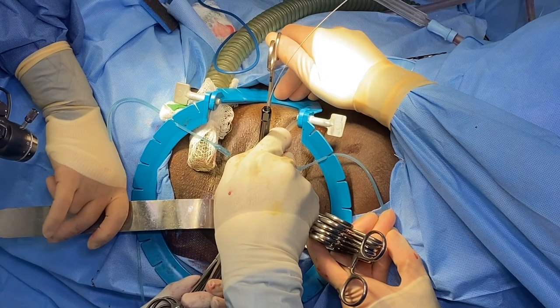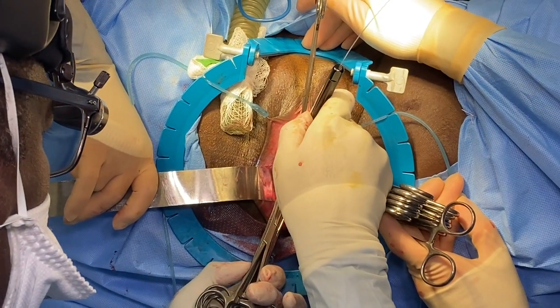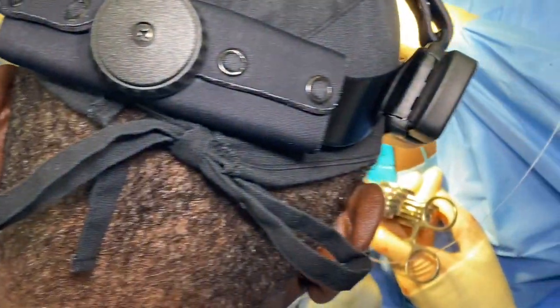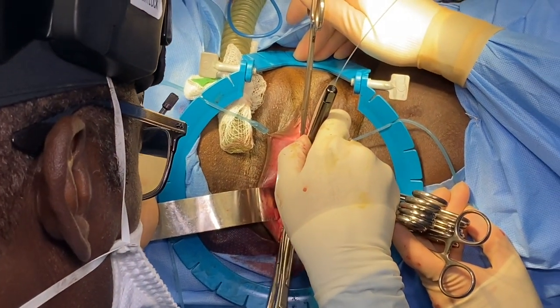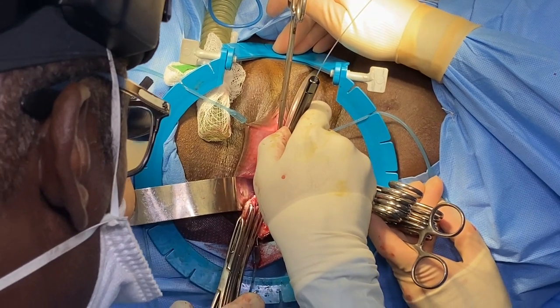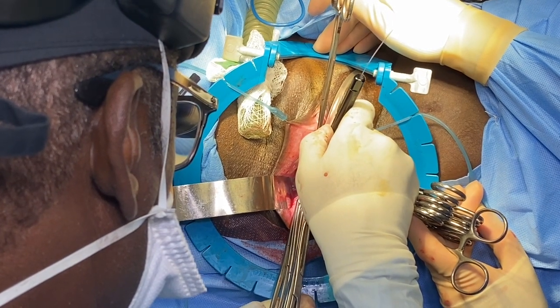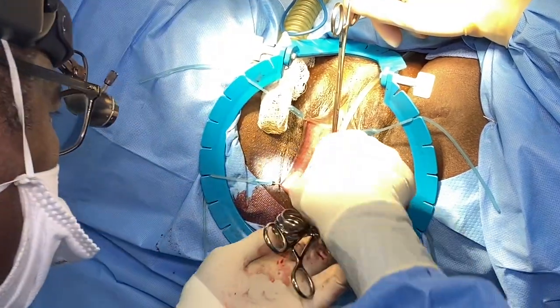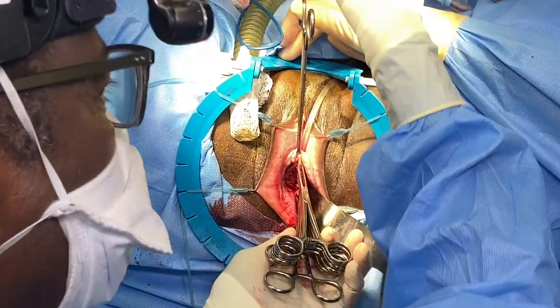This is the excess mucosa. We've got to resect it on both sides. Go to the other side now. We're going to do the same thing. Laser. We'll bring you back in.